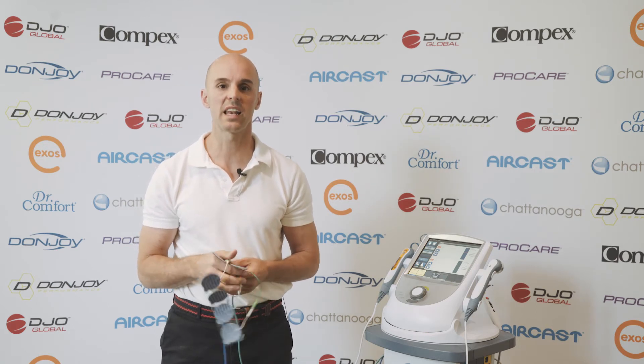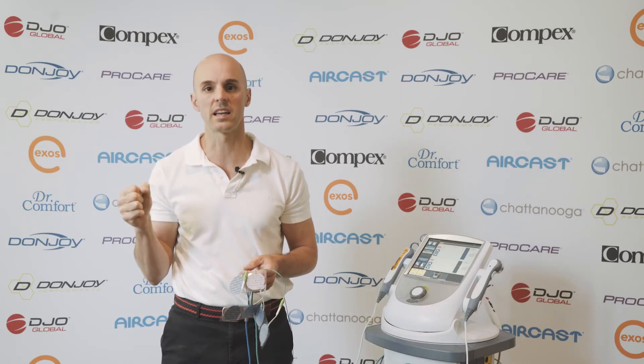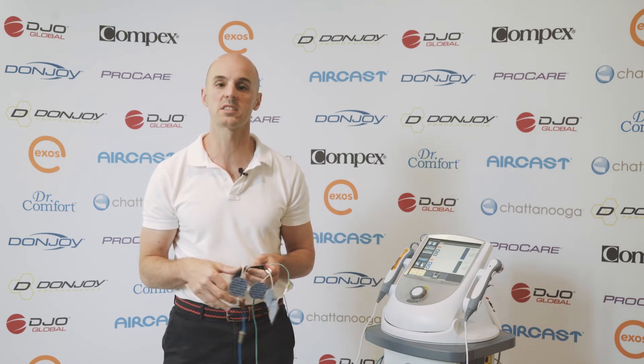So the EMG takes all the guesswork out of it. It allows us to really refine our programming and have accurate benchmarks to measure. I wouldn't be without one — it's just one of those things you can't do accurately by feel, and you just can't track change and progress very well without it.